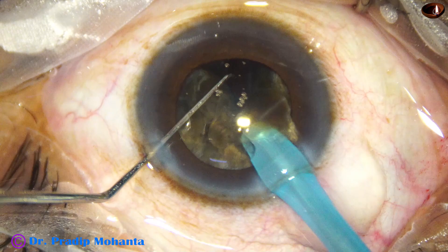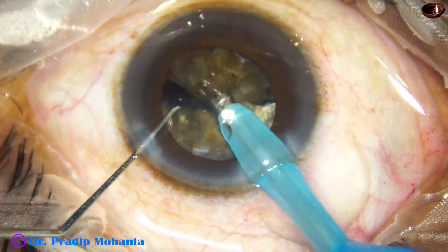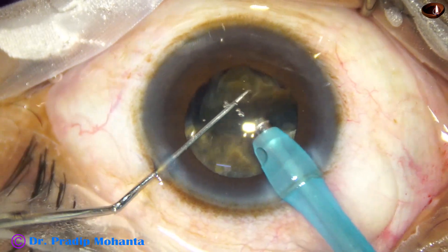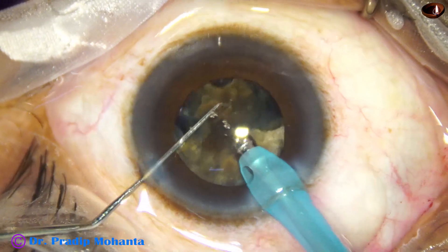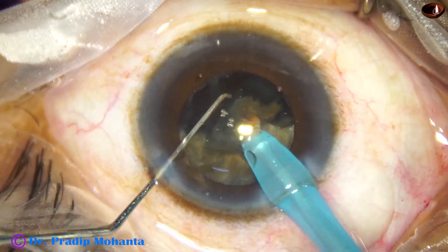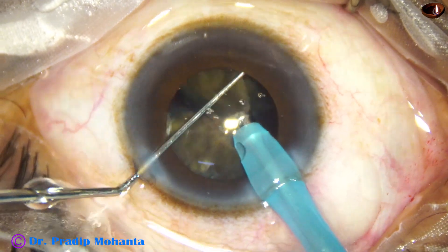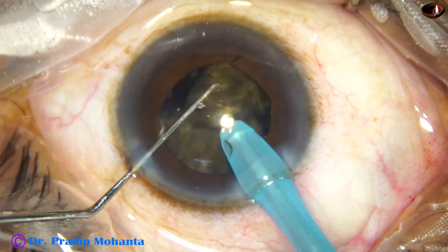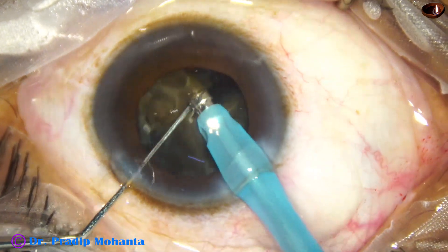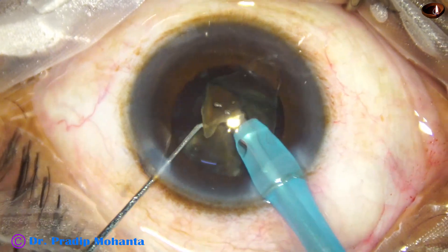Now let me tell you the settings. Ultrasonic energy is set at 90 percent in continuous mode, and I am using the foot switch to get the adequate amount of energy. The ultrasound is in linear mode, so whatever ultrasonic energy is required, I apply that. The power is 90 percent, flow rate is 48 ml per minute, and vacuum is 480 millimeters of mercury.